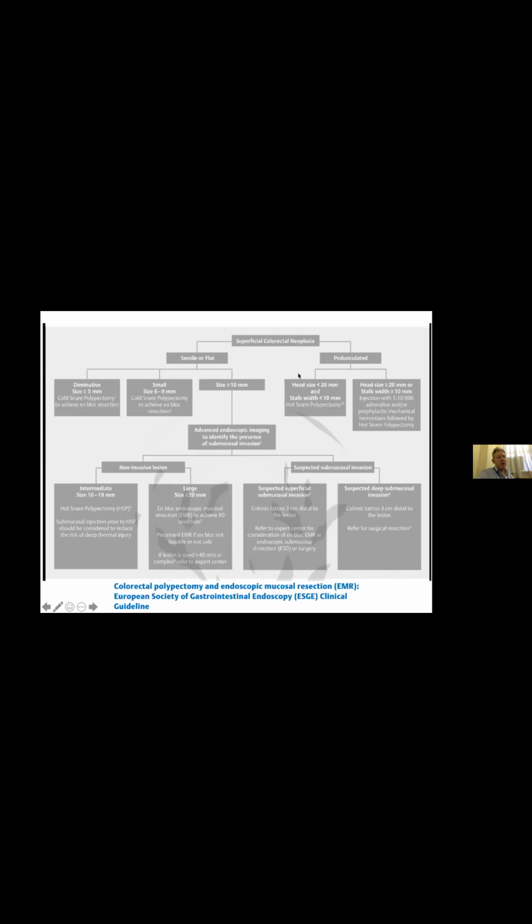If you've got a pedunculated lesion, you're going to do a hot snare polypectomy almost always, because you usually have a vessel in the stalk, and you need the diathermy to control that. And the moment you start getting very big lesions, we're injecting. I have to say, I almost inject every polyp that I do. It just makes me feel safer. I think it dissipates the load of electricity when you're using it. So if I put energy on a polyp, I inject.